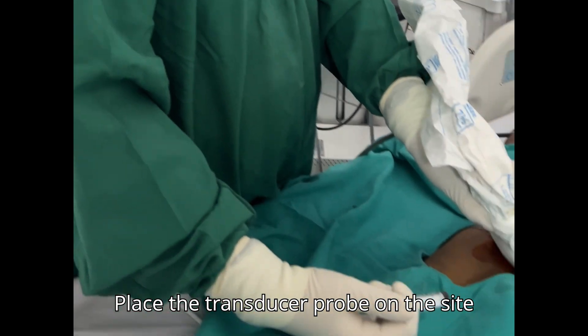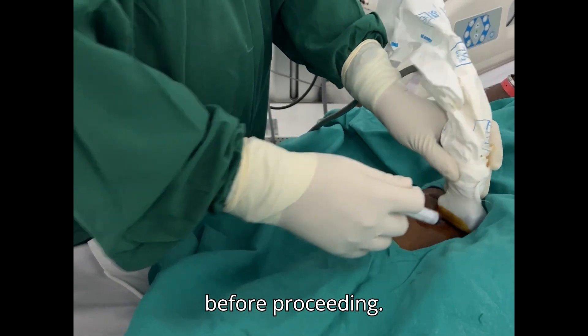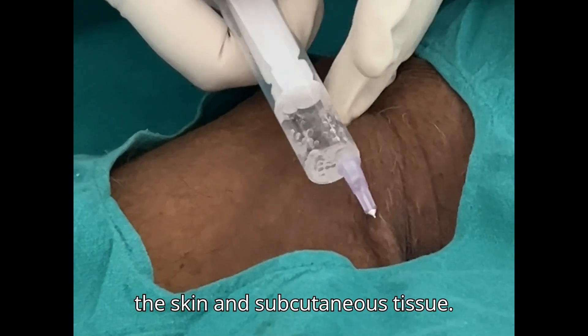Place the transducer probe on the site and confirm the location of the vessels before proceeding. Once the site is confirmed, anesthetize the skin and subcutaneous tissue.